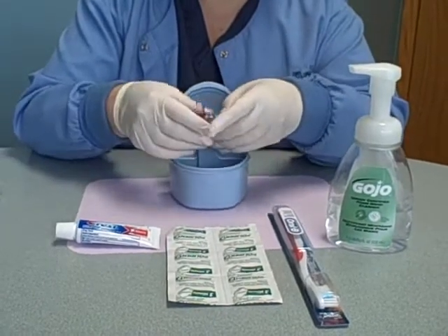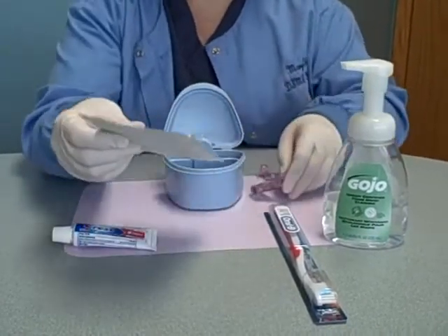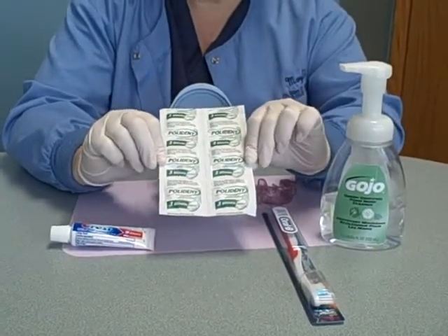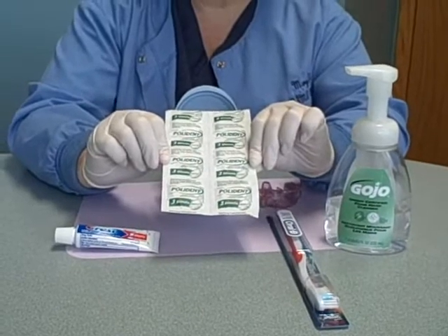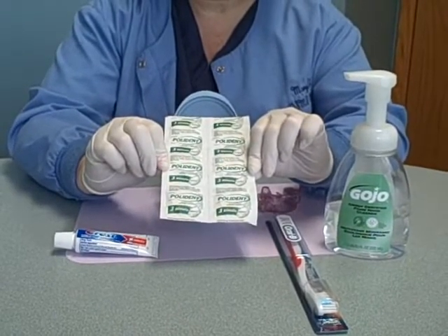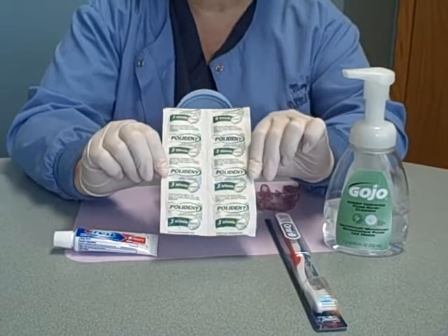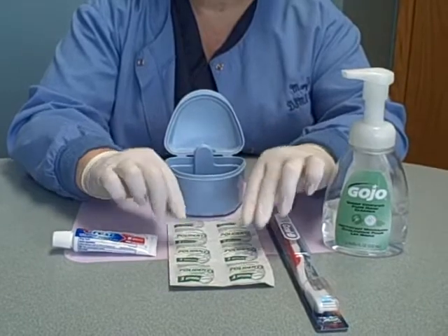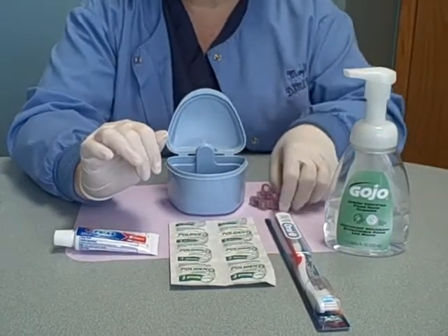Once a week, I would highly recommend using a denture cleaner. It's an over-the-counter tablet called Polydent — Polydent 3 Minute, Polydent for Partials or Retainers, or even Polydent for 5 Minutes. Any of those products are recommended. Polydent can be found at any big box store, and you should be able to find it without any problem.